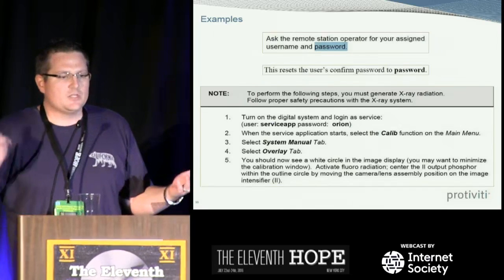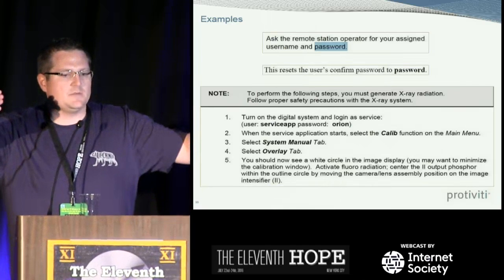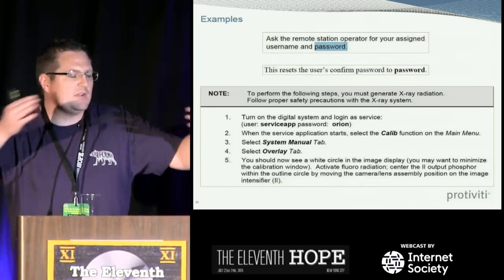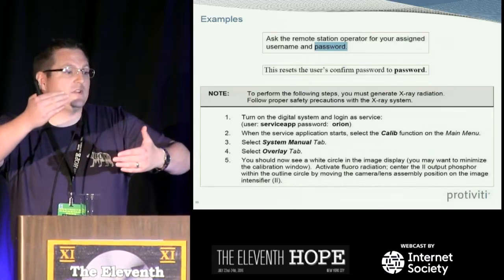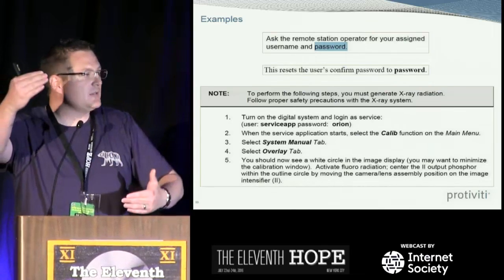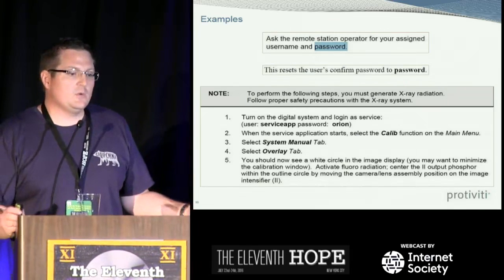Well, if you capture that traffic between the application and the web server on the actual X-ray system, it's not encrypted. It's an XML file that gets passed in many cases. You can modify those parameters. What happens if you modify those parameters to be higher, or the exposure length to be different, and then post it? Does it accept it? So that's the type of thing that we look at.